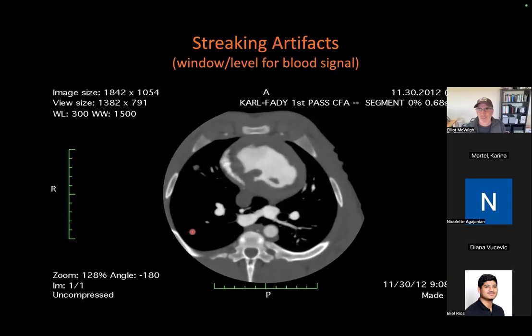And if we look at a movie that's taken, remember, each frame of this movie is usually just over 180 degrees of projection angles so that we can make individual pictures, right?